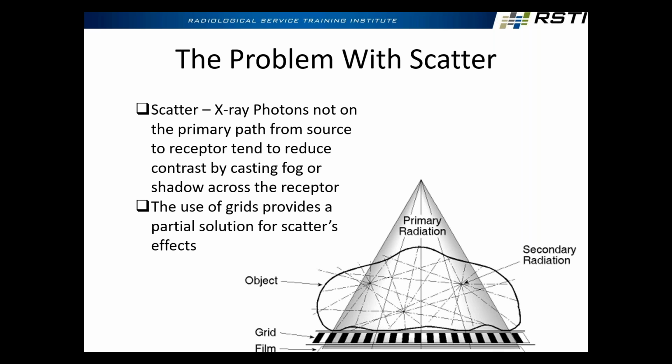The only major advancement that I've seen in these, other than going from an aluminum face on the grid to a carbon fiber reinforced panel, would be Hologic when they developed the HTC grid, the high transmission cellular grid, which is used solely in mammography, solely on their systems because they patented it. And instead of lead, it's like 7 layers of a copper alloy, and instead of aluminum in between, it's air. So the high transmission part, the cellular, because it is a grid, but it's a grid that's rotated almost 45 degrees. It's a whole crazy thing. They're expensive. It's like $20,000 for one of those grids.